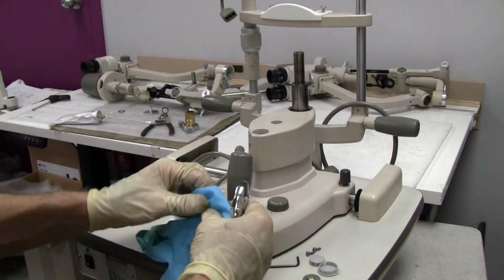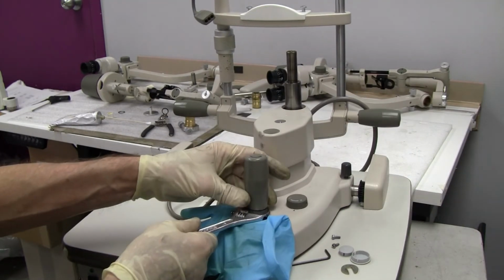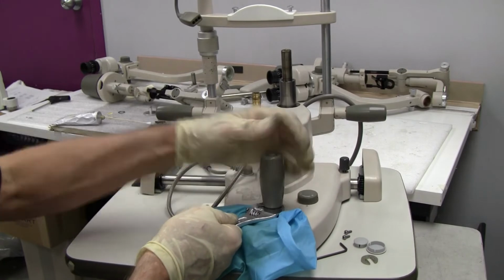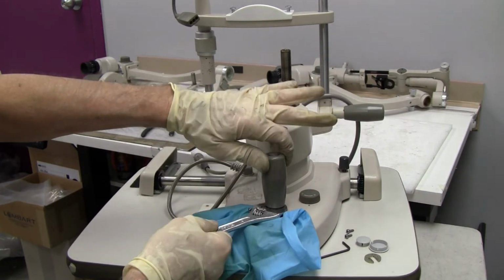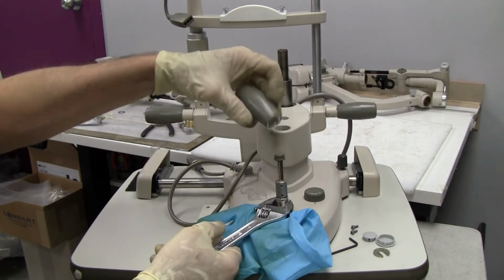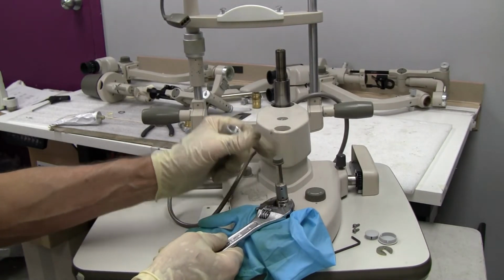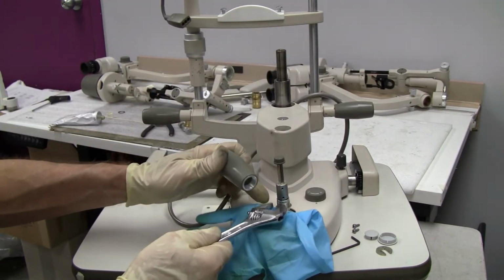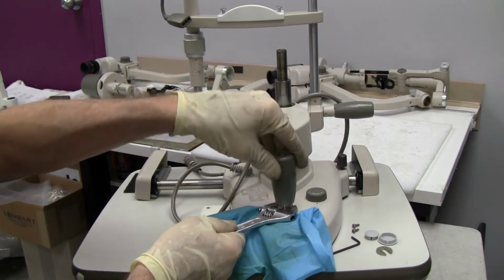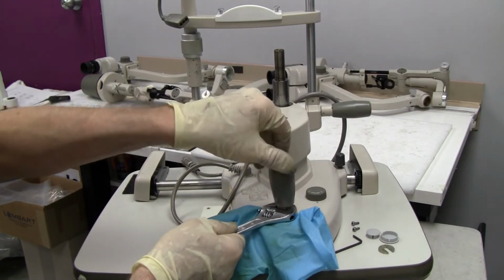When you're putting your pliers on, you might want to put something down to protect the paint. There's just enough room to get a small crescent wrench in there, and then you would turn it. This is holding it still, and then you would unscrew it. Now the button can come off easily. On and off easily. And when you're putting it back on, you would need to put your crescent wrench again back on it and screw it down. Screw it down tight.